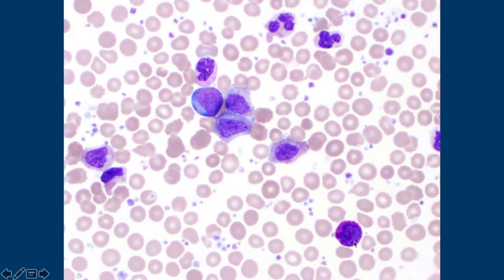That looks like an EO maybe. We'll see how wrong I am in a minute. And those I think are kind of blasty, or in the blasty type lineage. But I kind of wonder if they're at different levels of maturation, because they all look kind of different from each other. All right, so now tell me how bad I failed.